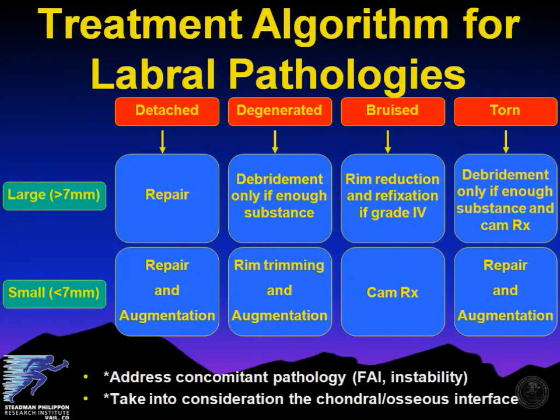This is a busy slide, but for the labral pathology, to sum it up, we try to preserve the labrum in most instances. We try if we have enough substance. If not, now we have evolved into considering labral reconstruction, because we feel that it's important, especially in these elite athletes, to preserve the suction seal and the role of the labrum. And my first 10 labral reconstructions were all professional athletes.